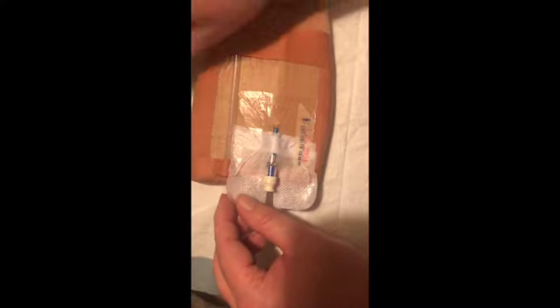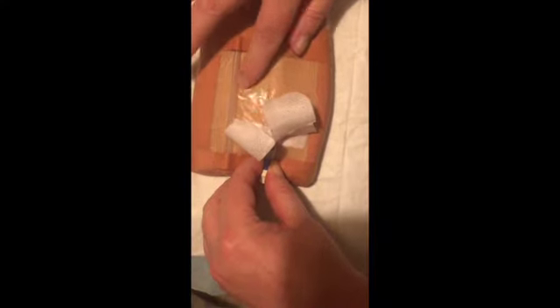You can also use your Unisolve or any adhesive swipes to help that dressing come away, particularly from dry or fragile skin. So you just move around the dressing, pulling towards that incision site, same on the other side, towards, and then back here.